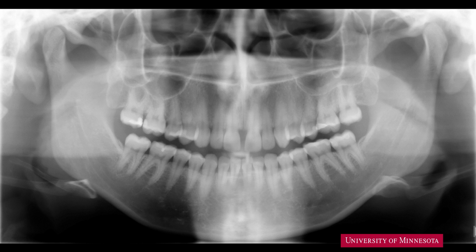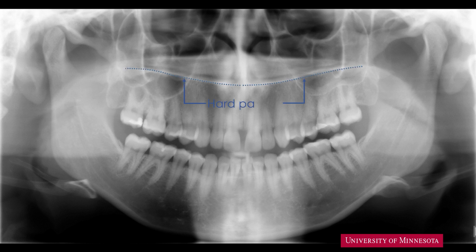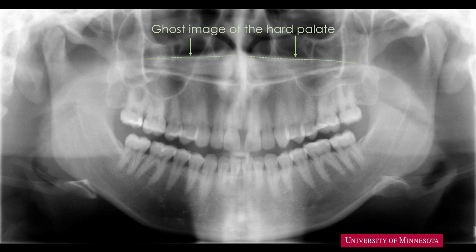Adjacent to the zygomatic process of maxilla is the wall of the maxillary sinus. Superior to the roots of the maxillary teeth is a linear radiopaque band — this is the hard palate. Superior to this well-defined appearance of the hard palate, there is a parallel fuzzy radiopaque line of contrast — this is the ghost image of the hard palate.